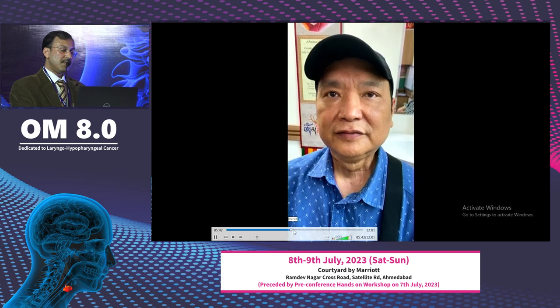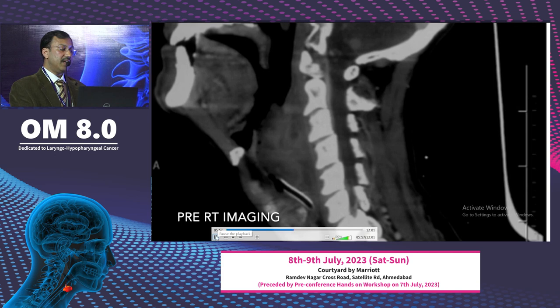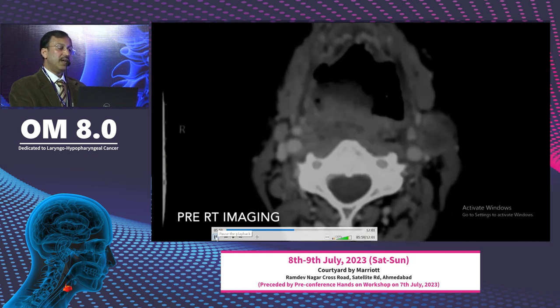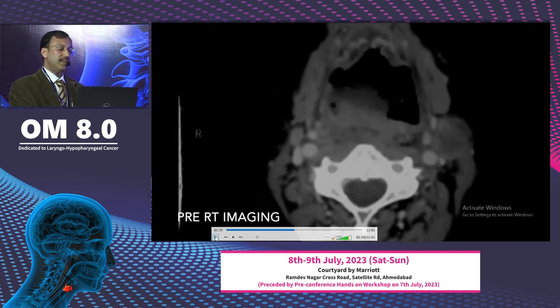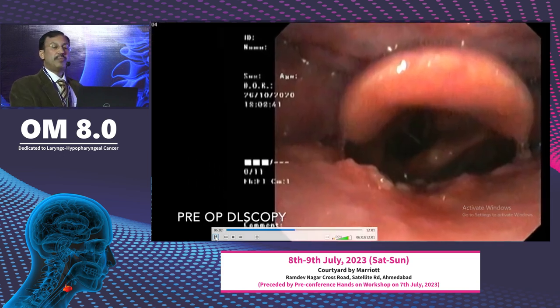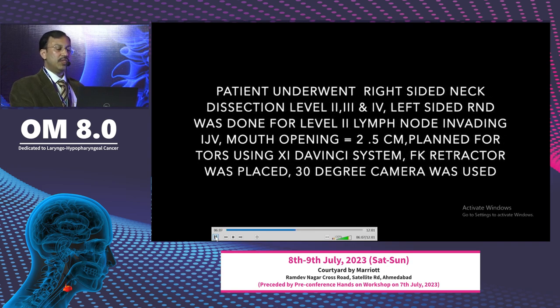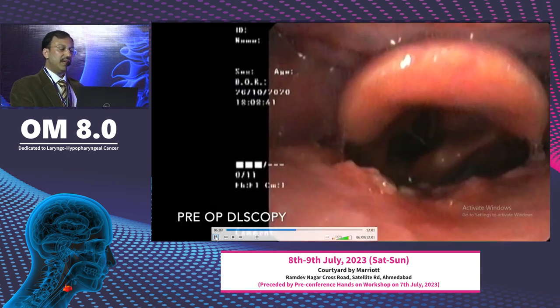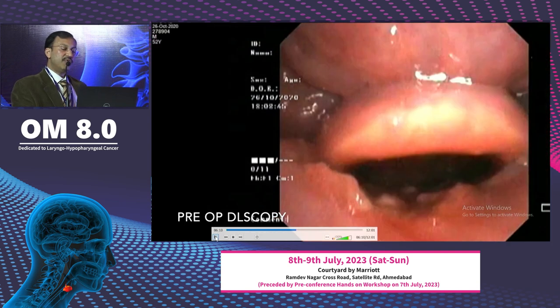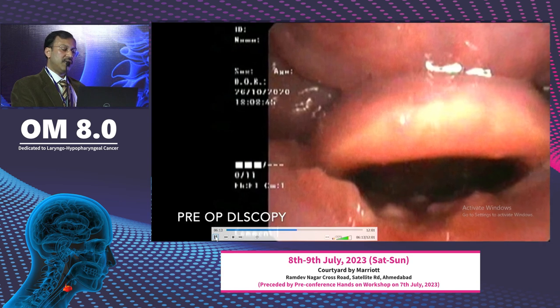So another patient of ours who had radical radiation for a posterior pharyngeal wall lesion and underwent tracheostomy and Ryle's tube insertion. He was from the Northeast, and in the 4th month the PET scan was done, which showed that the residual lesion is there on the posterior pharyngeal wall, going close to the PFS, and a node was there at level 2. So he underwent a radical neck dissection on the left side, and it was more on the left side. And we did a transoral resection for this.